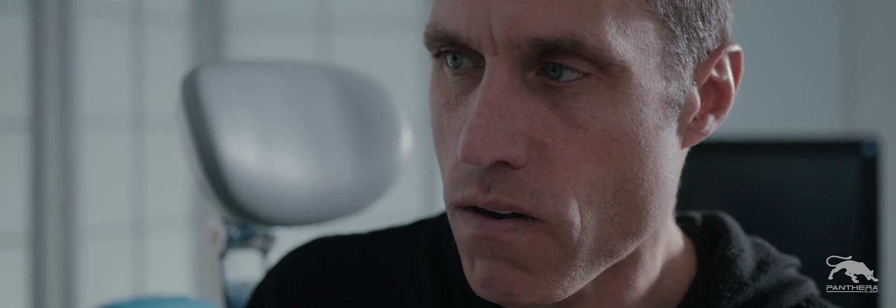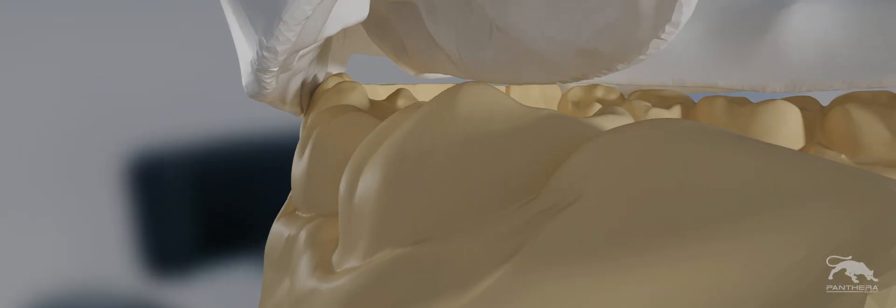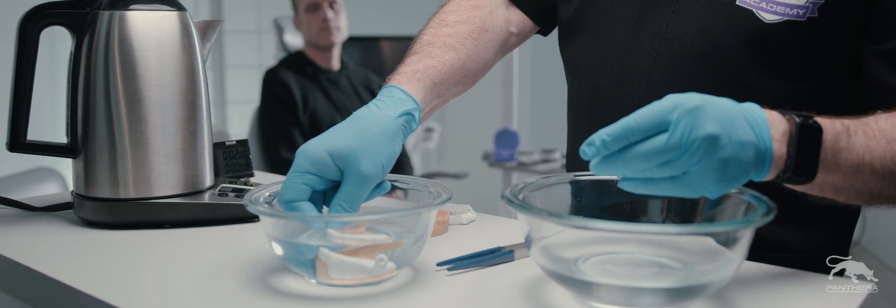For high retention, once heated, place the oral appliance about 2 thirds of the way onto the model in order to widen it. Then cool the assembly in this position under cold water.